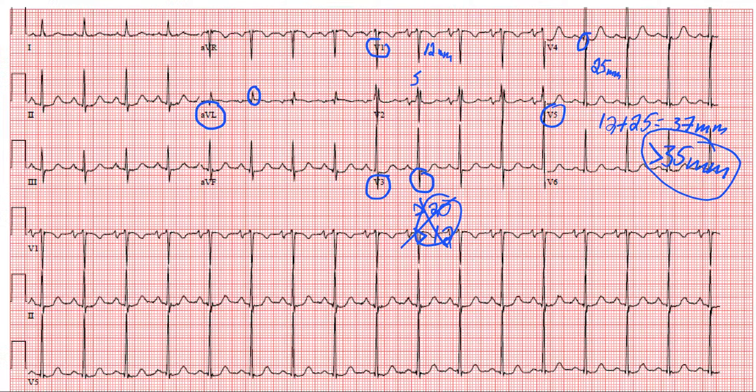So this is just an example of how different EKGs can give you different findings, and the criteria you use might be driven based on the lie of the heart, whether you would meet LVH criteria. So think about all your criteria. You can also have kind of moderate LVH or findings to demonstrate possible LVH. So these are all different ways to think about it, but in reality, if you meet with either the Cornell, modified Cornell, or Sokolow Lyon criteria, if you meet with any of those, you can say the patient does have LVH. So even though the Cornell is negative, or the Sokolow Lyon is positive for LVH, the patient still has LVH, such as in this case. All right, so that was a 5-minute EKG session on left ventricular hypertrophy.